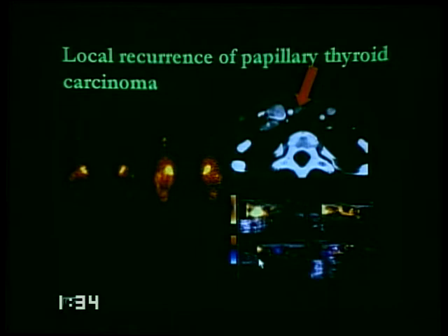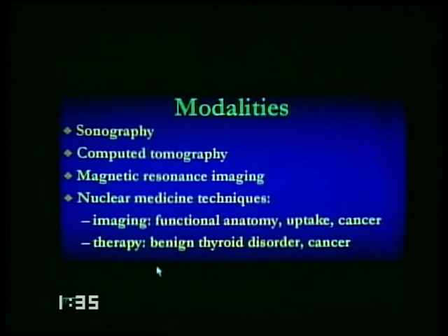The same with recurrent cancer. Recurrent thyroid cancer is going to show abnormal flow patterns. Again, when thyroid cancer has been detected, you undergo total excision of the thyroid gland, so there should be nothing that looks like normal thyroid tissue in the thyroid bed. Anything that comes back needs to get a nuclear medicine scan to see if it is functionally active.